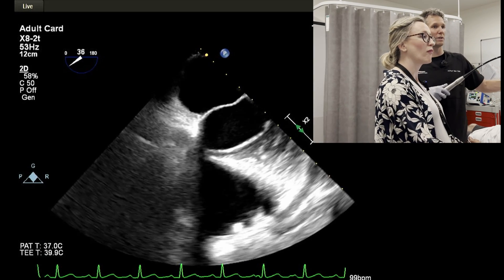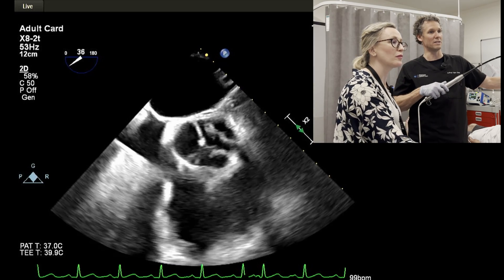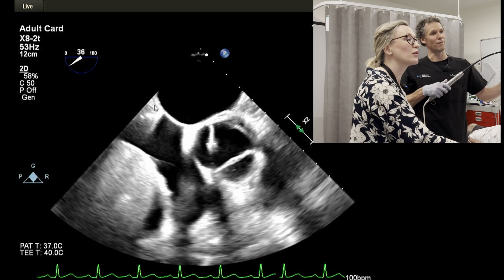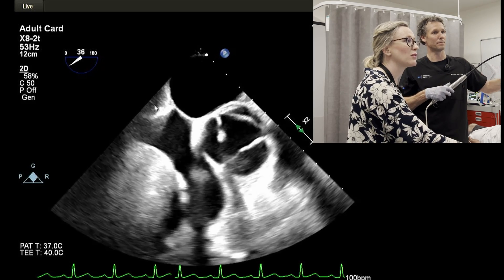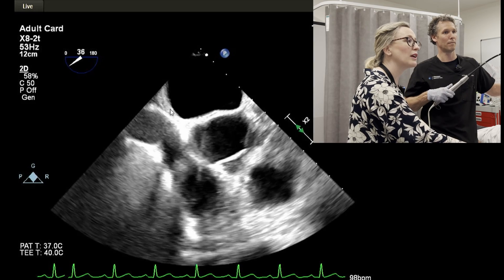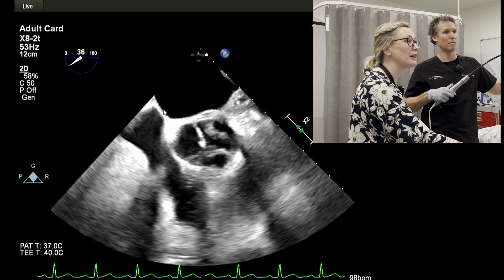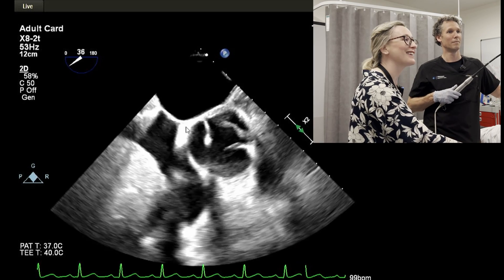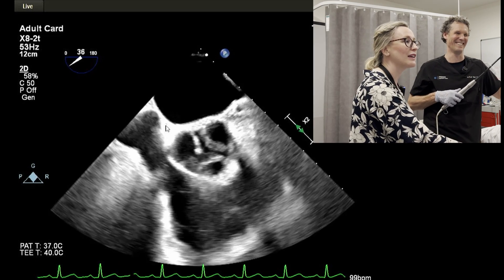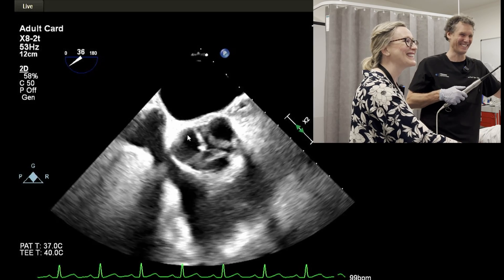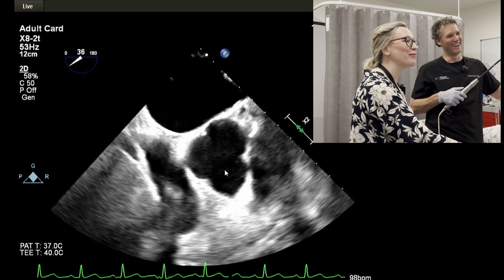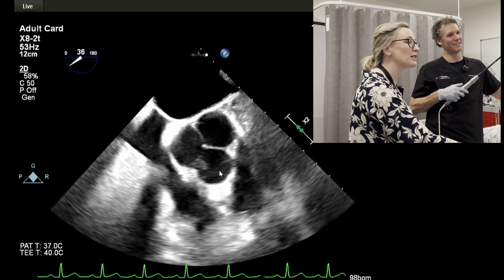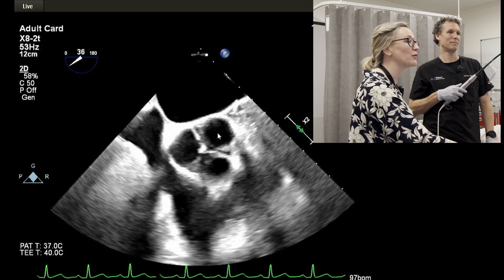So now I go down to about 30 degrees, pull up a little bit, and there's the short axis of the aortic valve — one of my favorite views in all of echo, just looks like a flower opening. You usually get this between about 30 and 50 degrees. We use the landmark of the interatrial septum — the non-coronary cusp likes to sit on the fence, next to the interatrial septum. The cusp next to the right ventricle is your right coronary cusp, and then we have the left coronary cusp here.